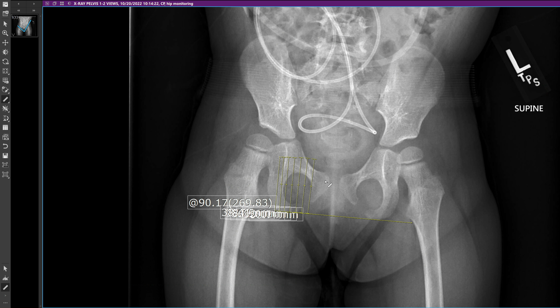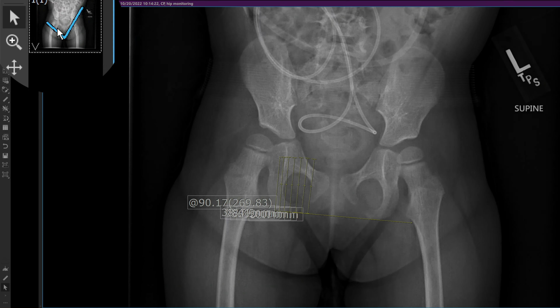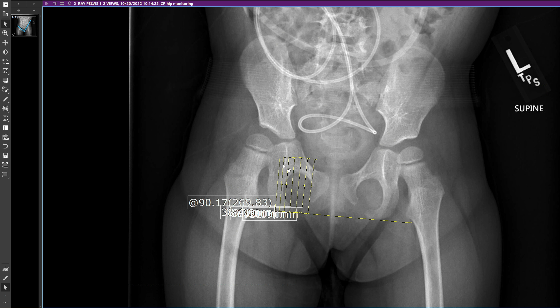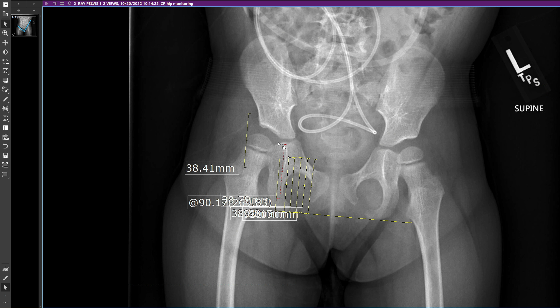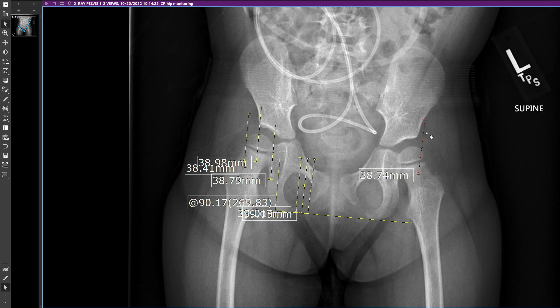Now we've drawn our relatively parallel six lines. I'm going to move them to the appropriate locations using the arrow tool. The first one is going to be at the very lateral margin of the femoral head. The second one is going to be the medial margin of that head. The third one is going to be a line drawn from the edge of the acetabulum. Similarly, we're going to do the measurements on the left hip.